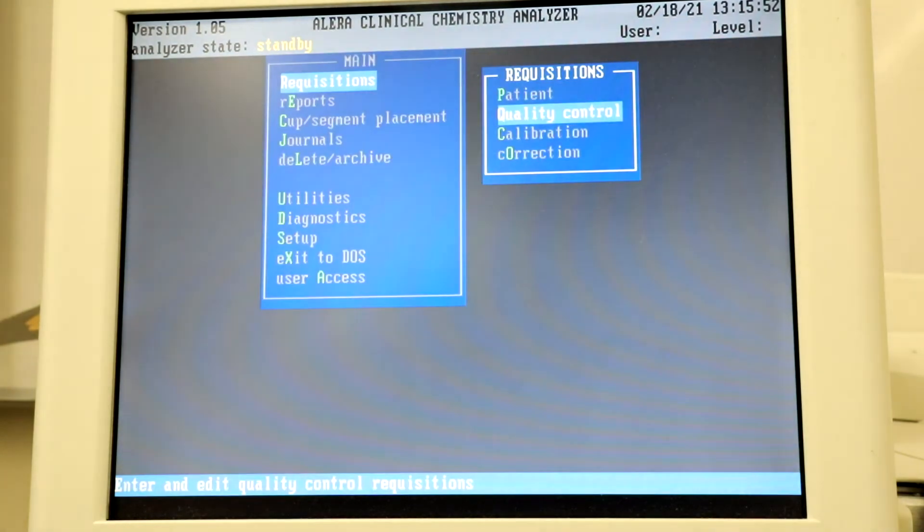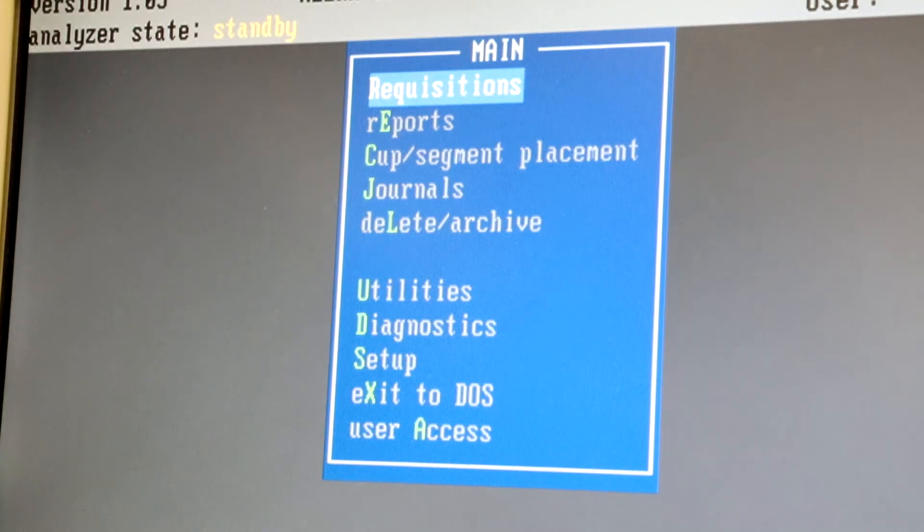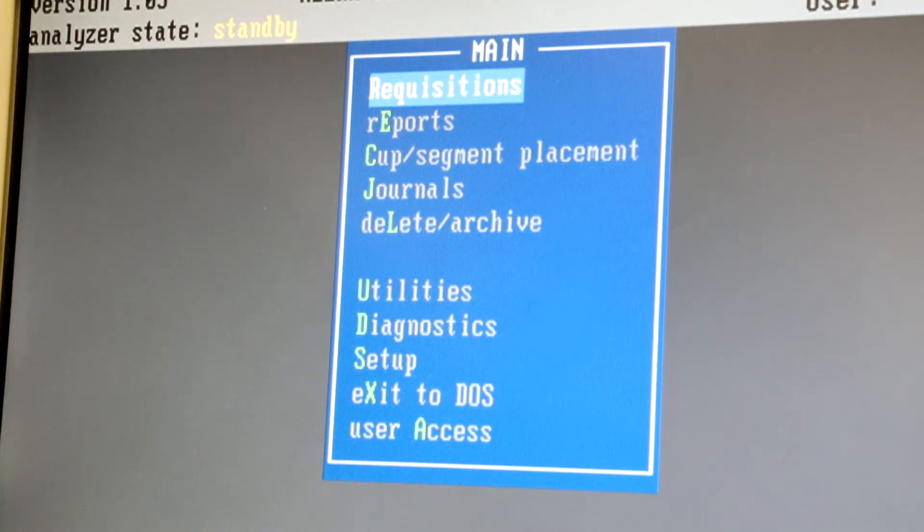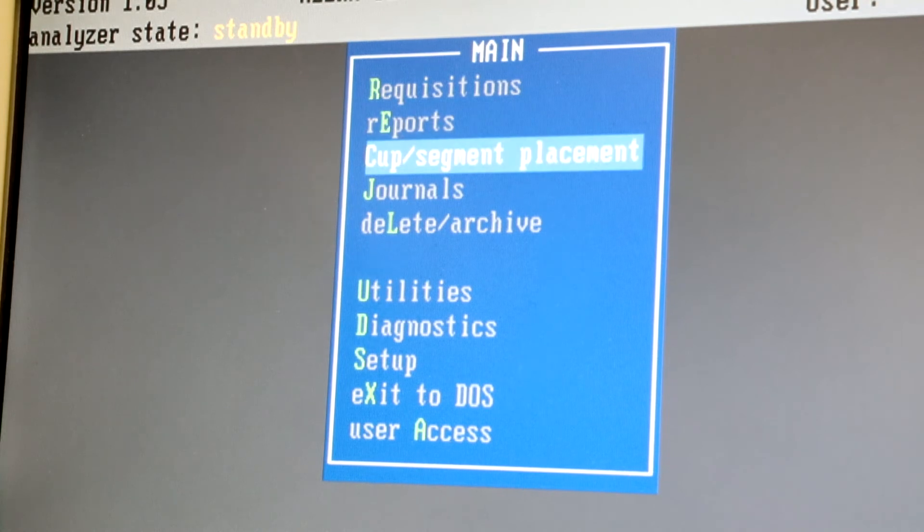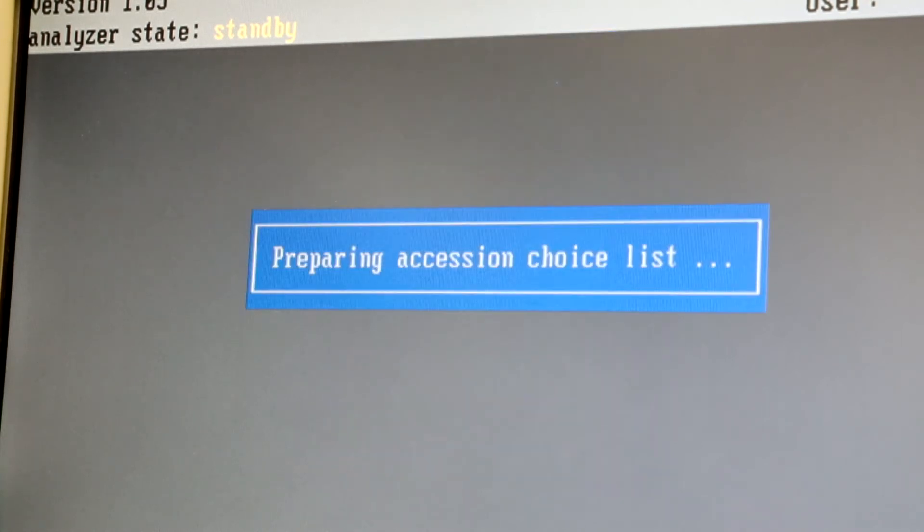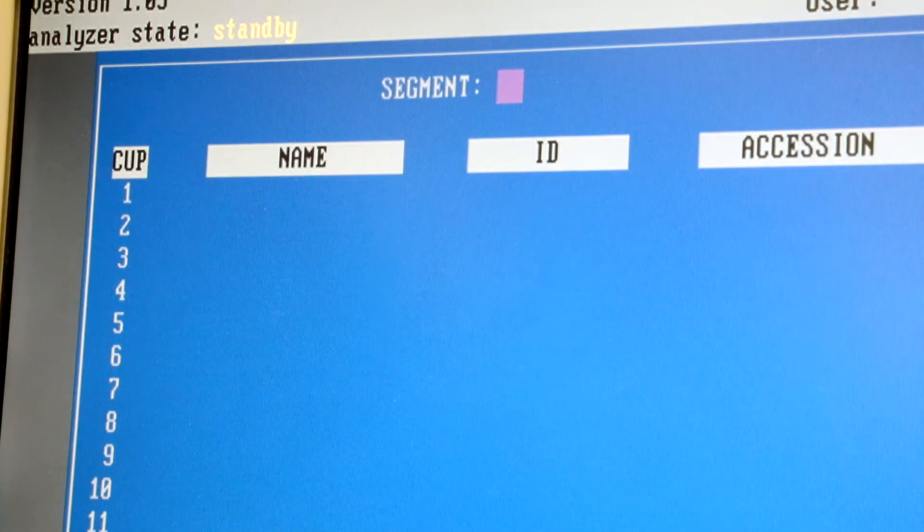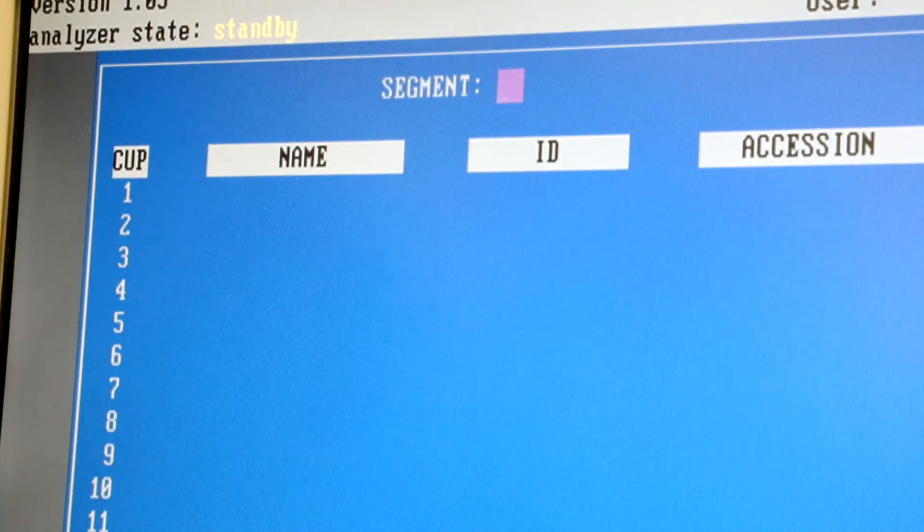For instructions on calibration, see the calibration video. To continue with QC, select Cup Segment Placement.